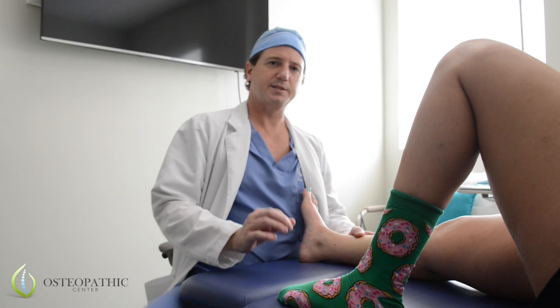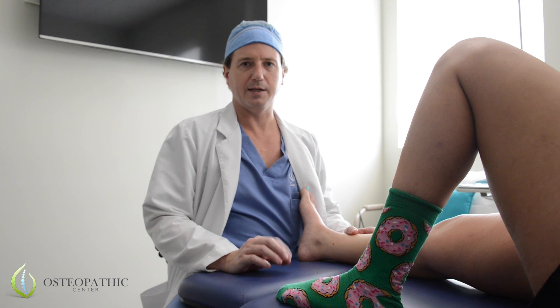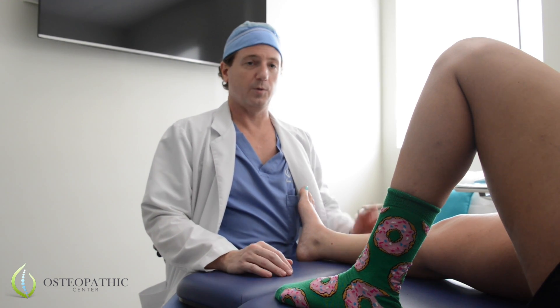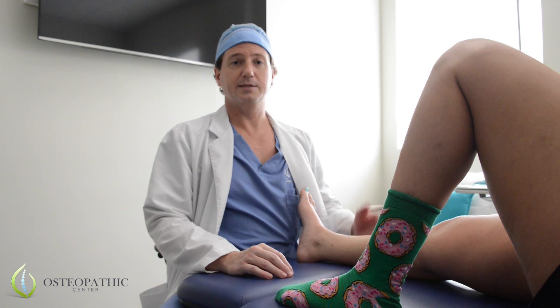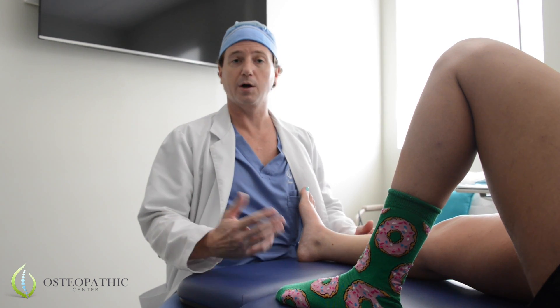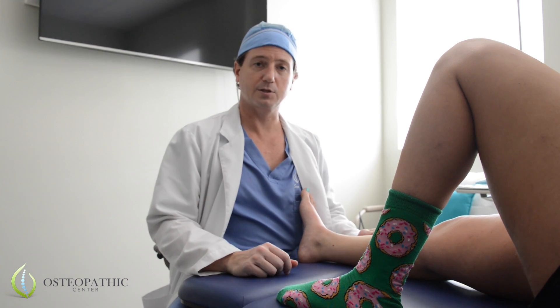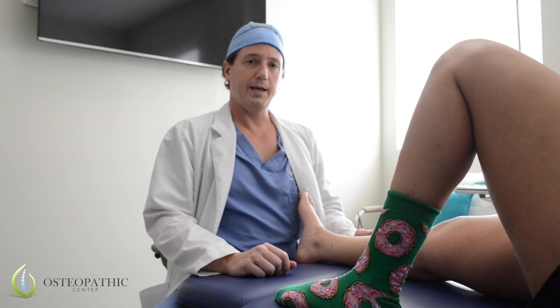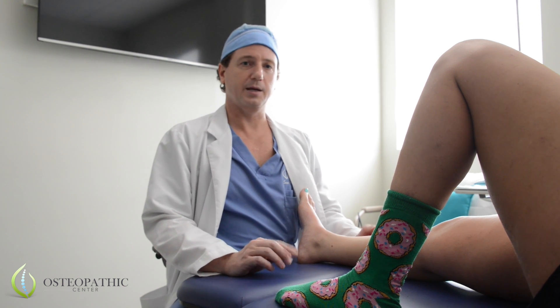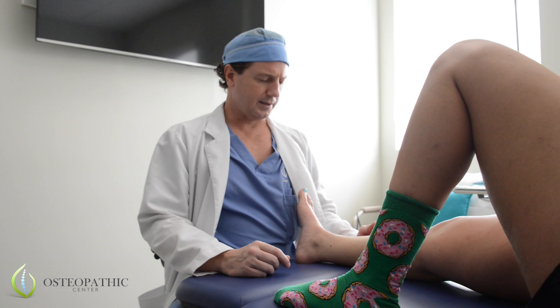When we're trying to focus and get the exact spot of pain and injury, it takes a few different things. One is the patient tells us what they're feeling. The second is imaging — we have x-rays, we have ultrasound, MRIs to do that. And then we have our hands, our physical exam. It becomes extremely important to correlate what we see on imaging with that.